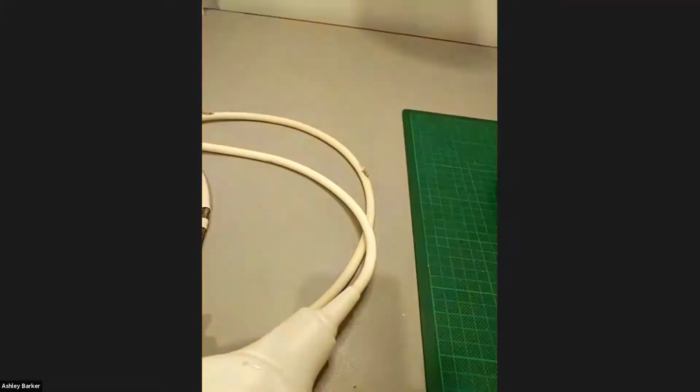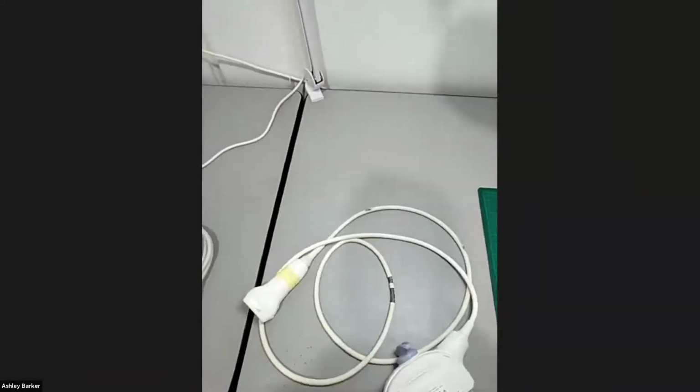Gosh, it's amazing that it's taken the manufacturers this long, particularly for point of care, where the machines are moving around more, to realize that having the transducers plugged in on the lowest point of the machine often is not a great idea. Yeah, it's kind of awkward, isn't it? Logically, why didn't you have the transducers plugging in three quarters of the way up the machine before? Yeah, it makes so much more sense. And if you're lucky enough to have a fancy new ED, the machines are getting fixed in gantries over the bed, so they're not going to have that issue because they don't need to wheel the machines around so much.